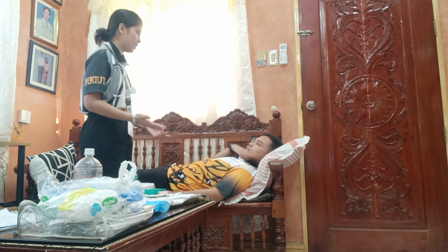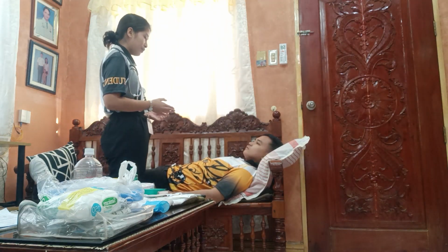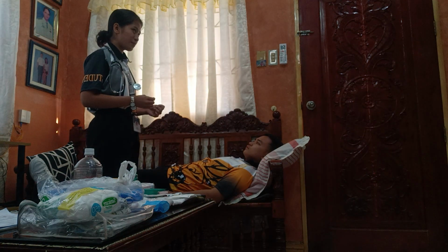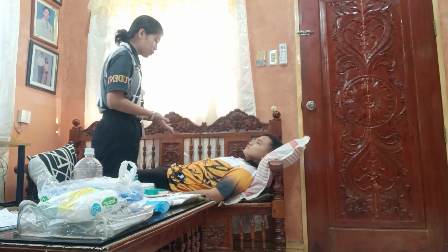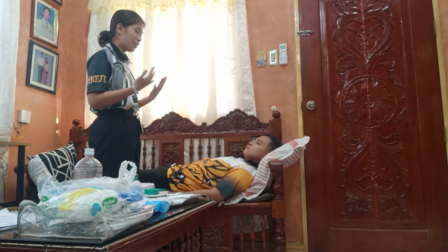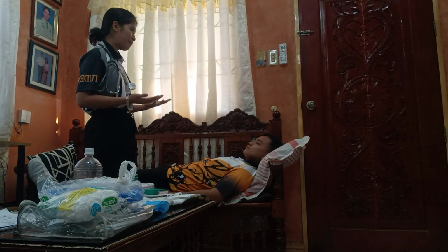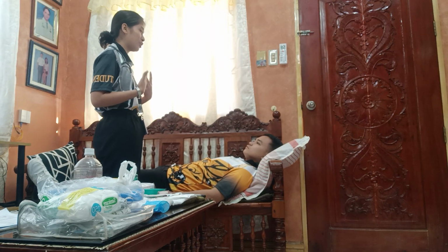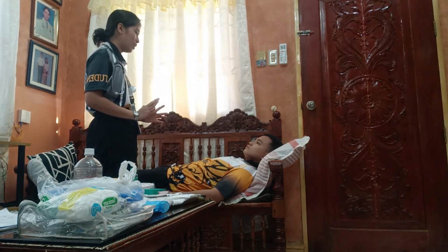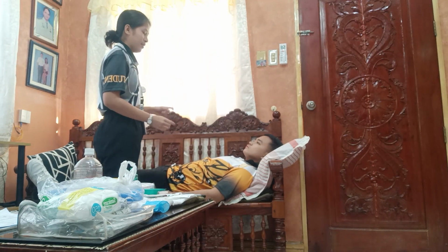Sir, ngayon po is i-perform ko po yung NGT insertion po. Lahat naman po ng procedure na gagawin natin ay i-explain ko po sa inyo. Yung NGT insertion po na ito ay way para po makakain, marami pa rin pong nutrients na pumasok sa katawan niyo, lalo na po ngayon at na-operahan po kayo.